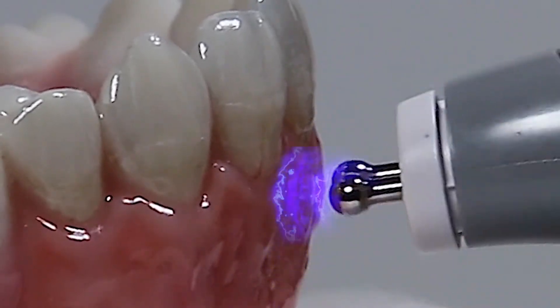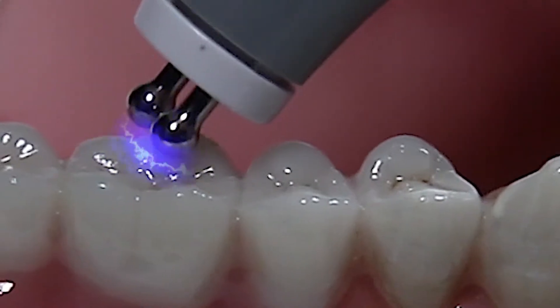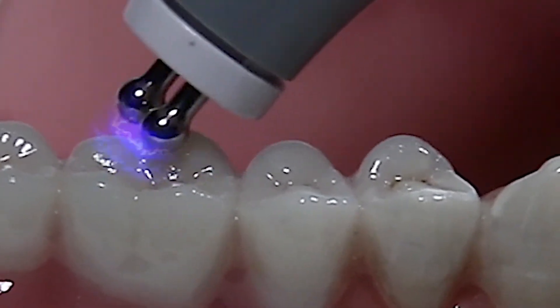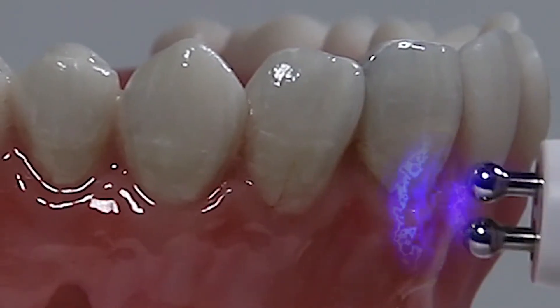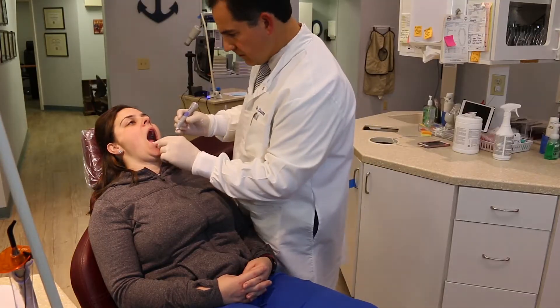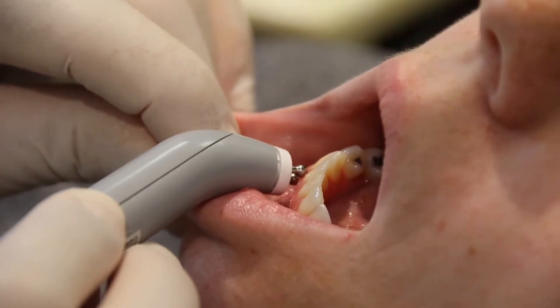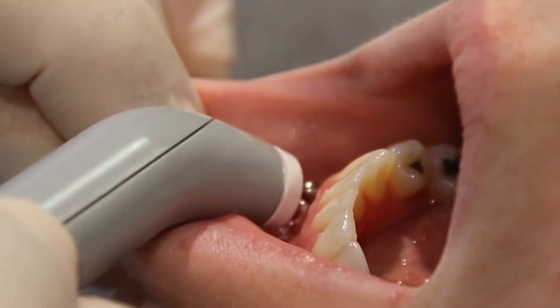Electrodes from the device deliver a subsensory electrical current to the pain-affected area. A 10 kilohertz current interferes with and blocks the transmission of pain stimuli to the brain, resulting in a safe and non-invasive elimination of pain and discomfort without any need for anesthesia.